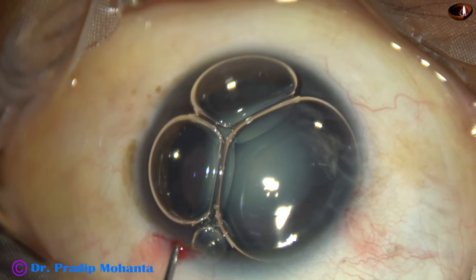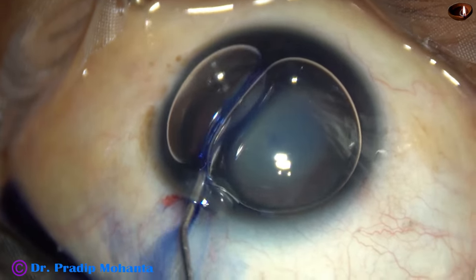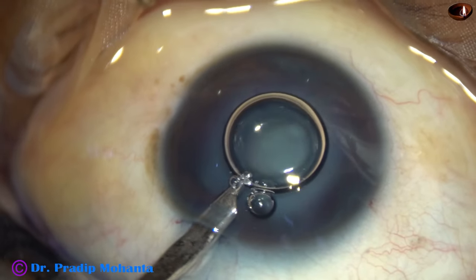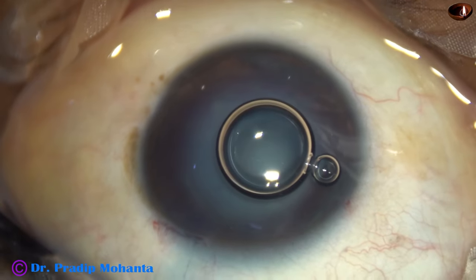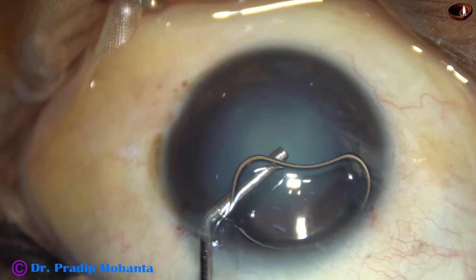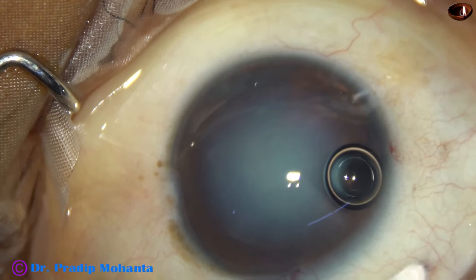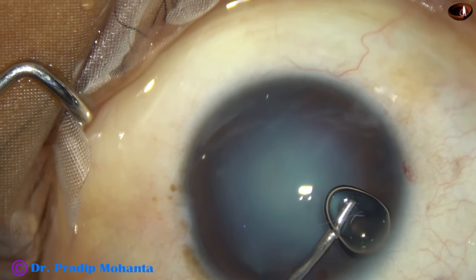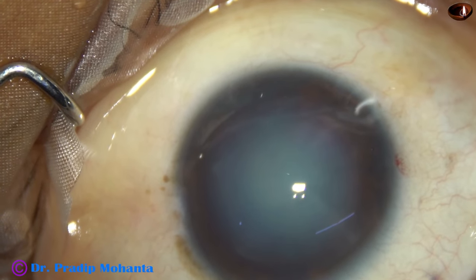The anterior capsule is being stained with trypan blue dye. The dye is washed out. The anterior chamber is filled up with 2% hydroxypropylmethylcellulose. The air bubble is removed by visco.